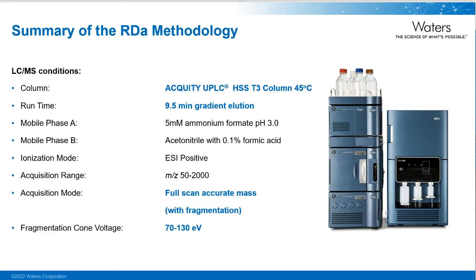Fragmentation is induced by an increase in cone voltage energy from 70 to 130 electron volts and occurs within the source region of the instrument. Let's take a look at why fragmentation is so valuable.